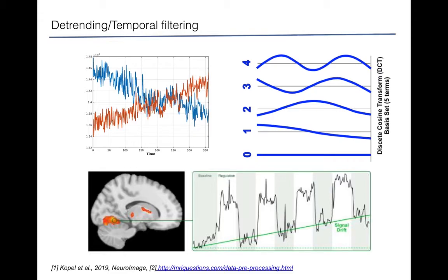One thing that I would actually like to repeat here is that something like low frequency drift, which again for many studies is considered noise, might be the signal of interest for some studies. For example, if there is a study looking at the effect of some drugs, there might be changes in the brain state over time during the scan, which may cause a drift in the time series.